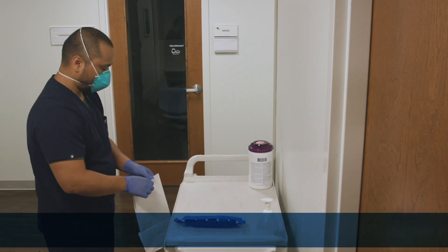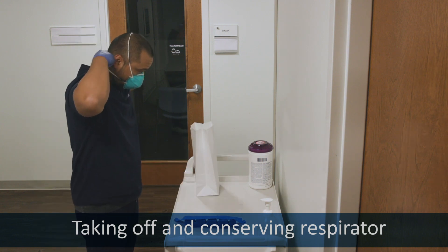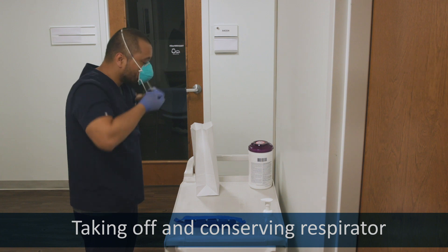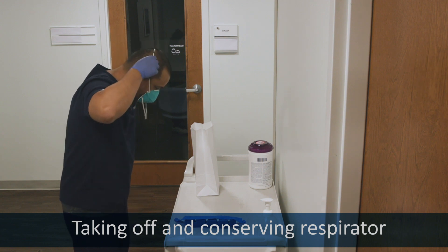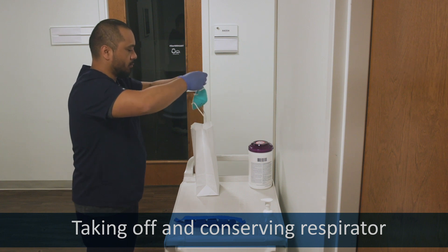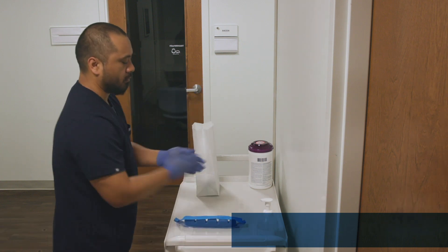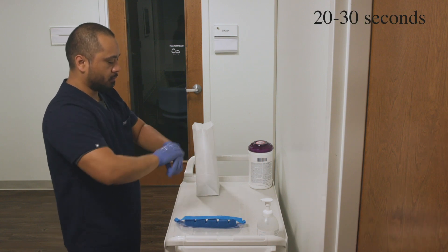Remove the respirator. Grab the lower strap of your respirator and pull it back and up and over your head without touching it to your face. Do the same with the upper strap slowly until your respirator comes off. Place the mask in the designated bag or container to preserve the mask. Sanitize your gloves.